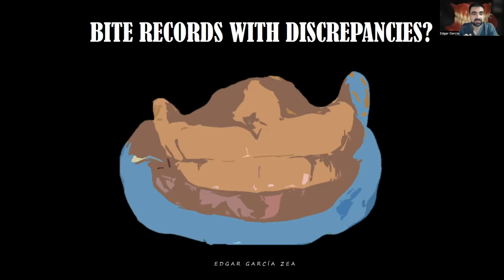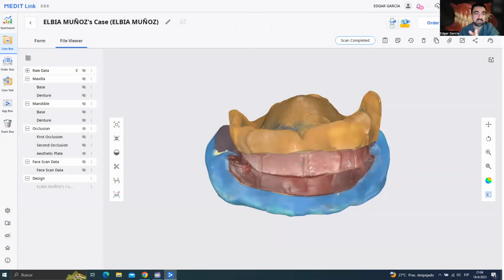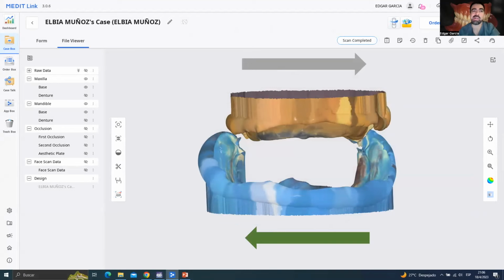The way that I normally do it, honestly, is I separate the rims a little bit in the back. I create some space in the back. I have some notches, and I use PVS that interlocks between the upper and the lower rims. For me, the technique that obtains a better occlusal registration is the Gothic arch trace technique. You can see in this patient, I tried the classical way with occlusal rims, but the patient was all like this all the time. Right. All the time.